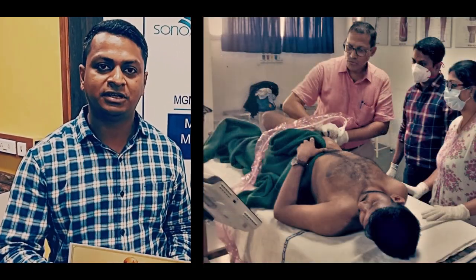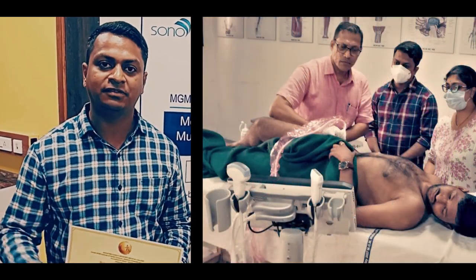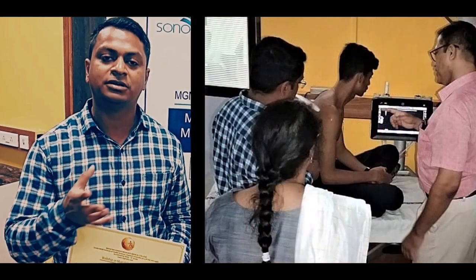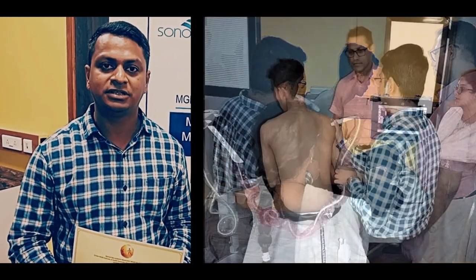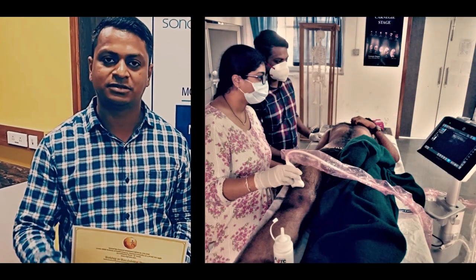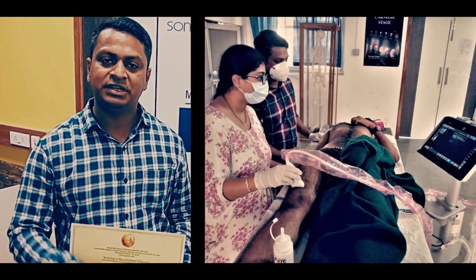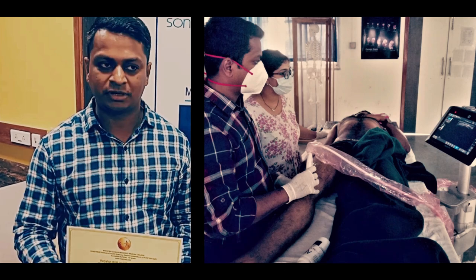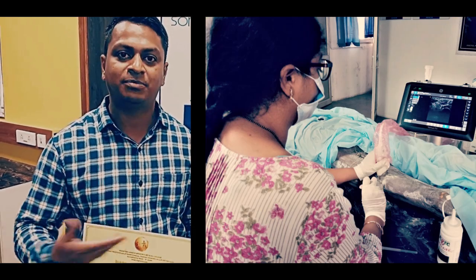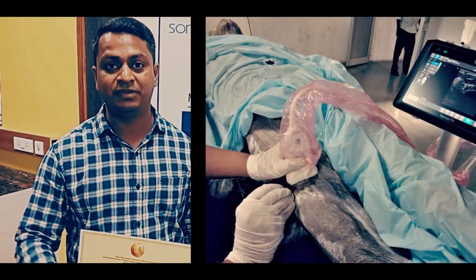After the cadaveric session, we were then shown on live volunteers as well as on the cadaver. Needling was done on the cadaver and on live volunteers we could scan all the structures in a very nice way. Overall I am very very happy with the way this program has been organized — it is a very systematically organized program, so I am looking forward to doing it again so that I can improve my skills and do it in a much better way next time.